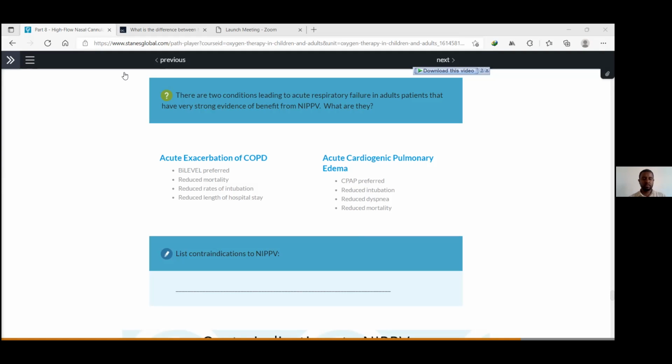So, contraindications to non-invasive intermittent positive pressure ventilation: unconscious patients, upper GI bleeding, frequent vomiting, uncooperative patient, mentation change. Excellent, thank you so much. And patient's refusal, depressed mentation, unable to protect airway, thank you again. Unconscious, uncooperative patient, excessive secretion, thank you.